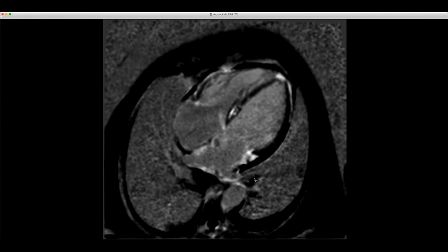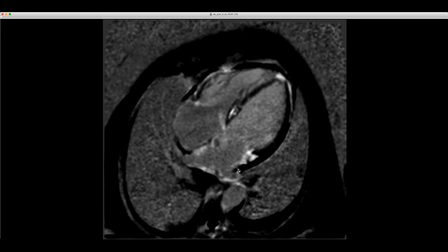This is presumably amyloid with a predominantly left atrial pattern. They have not had afib ablation to explain this, and there wasn't really any noticeable mitral insufficiency or anything else that would suggest a possible cause. So presumably this is amyloid predominantly affecting this area of the left atrial wall and the basal septum. I was wondering if any of you had seen similar cases, because I've never seen a case like this, and Dr. Stillman hasn't either.